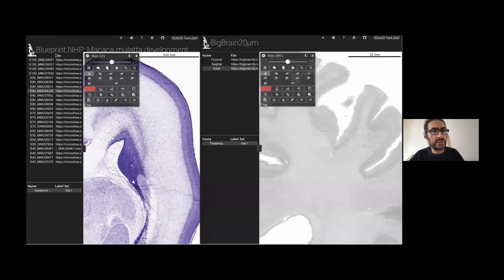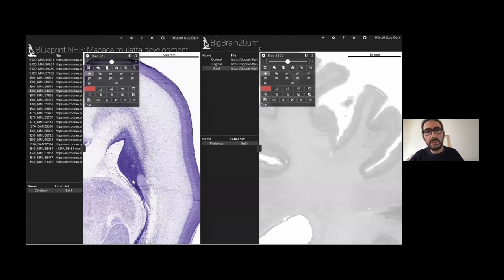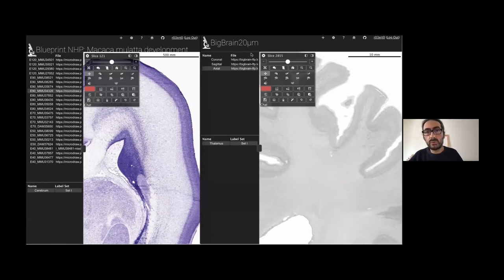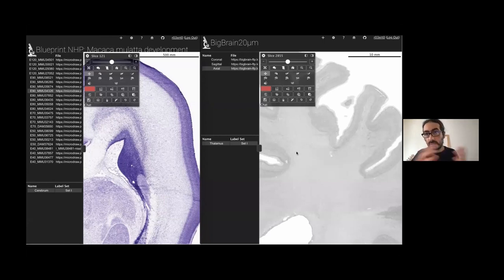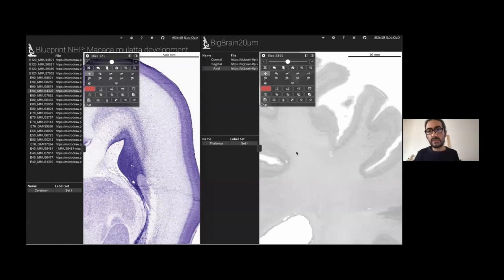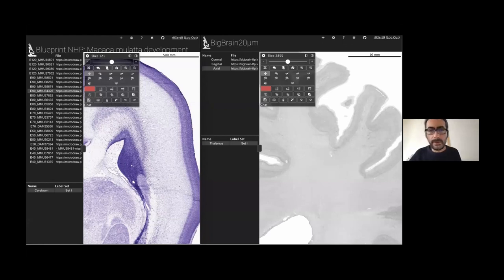Here, you have an example of the Blueprint NHP, Macaca Mulata development, BigBrain. Claude Lepage was very kind to put the data already super nicely organized. And then you have the 20 micron version of the BigBrain available in coronal sagittal and axial slices. You can immediately go there and start working instead of listening to me.